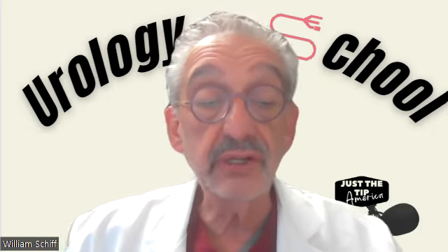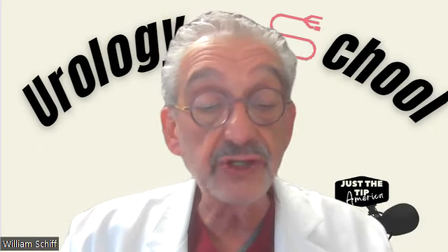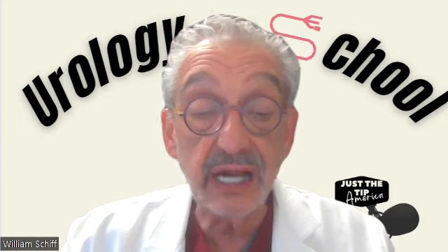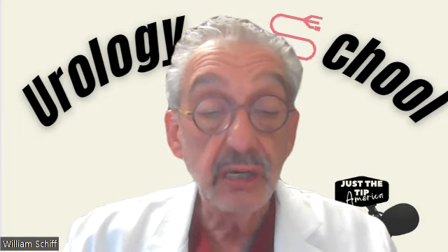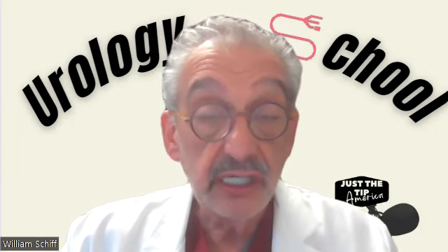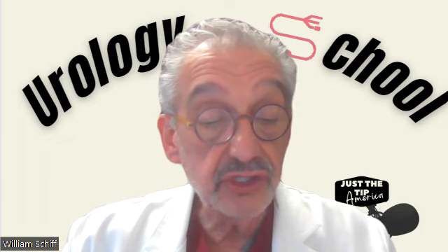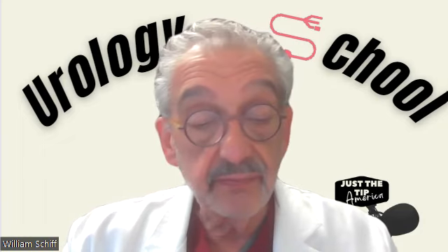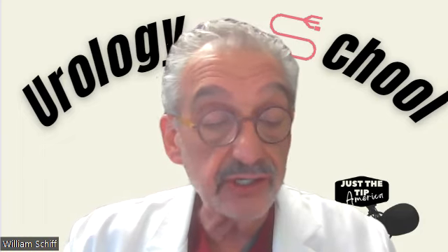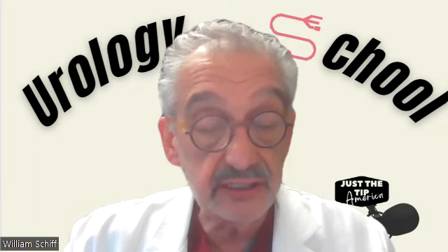After ultrasound, the MRI is the modality of choice for patients with iodine contrast allergies, mild renal insufficiency, and pregnancy. It is, however, very poor in detecting stone disease. Gadolinium-based contrast should be avoided during pregnancy and lactation.